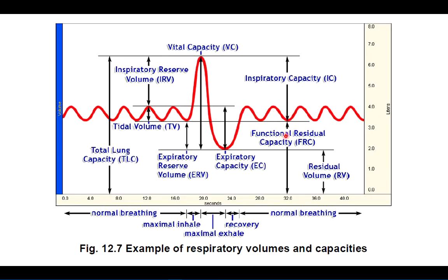We also see a couple other terms here: functional residual capacity, residual volume, and then total lung capacity. These are other marks that we're going to measure in the lab.